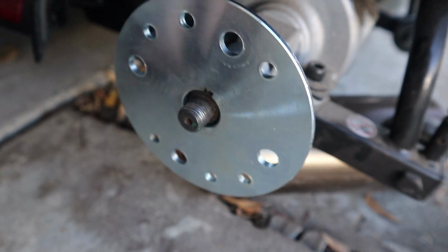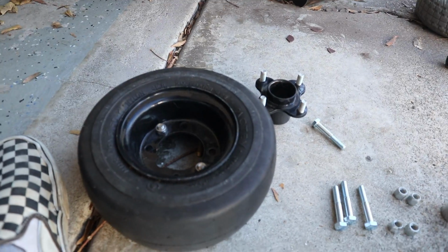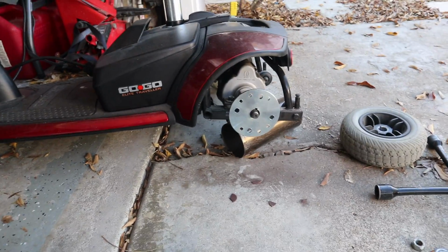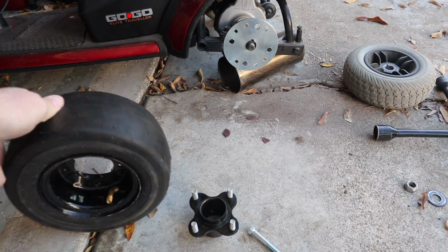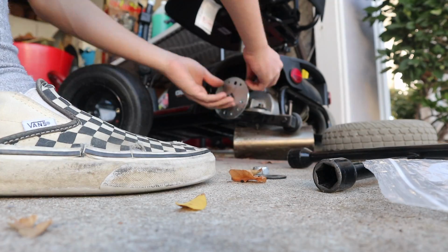So now I can throw the bolts on and throw the wheels on, and we should be good to see how this officially looks, which is super exciting because I haven't done it yet, and this is my first time seeing it with the go-kart wheel on. So I'm gonna go ahead and throw that on.